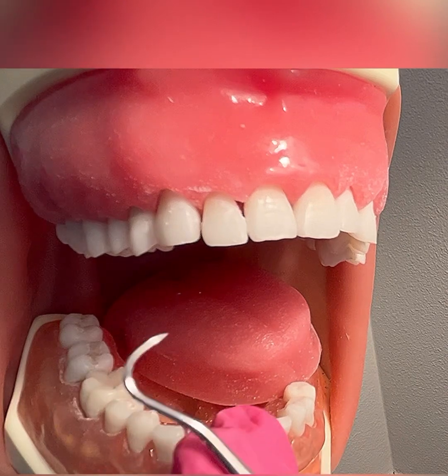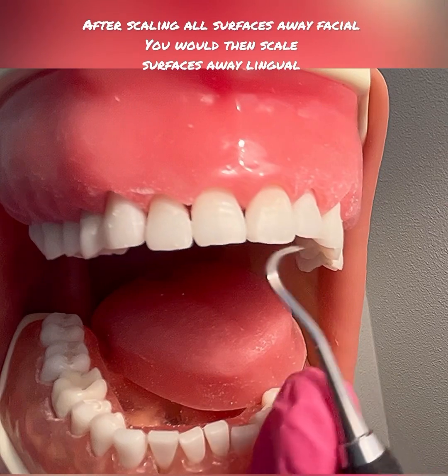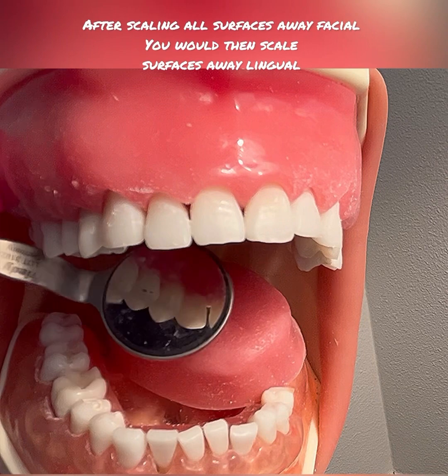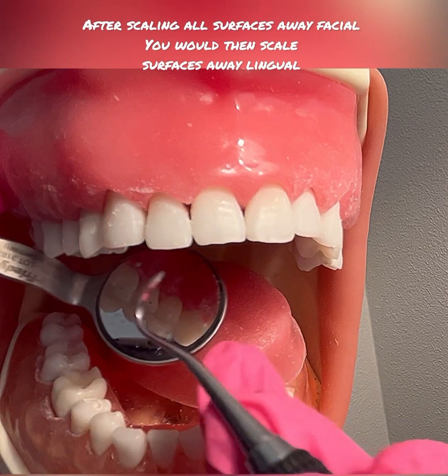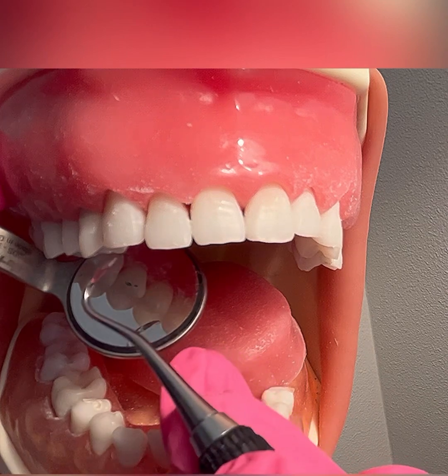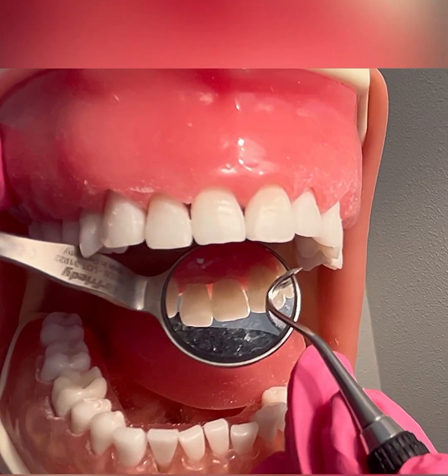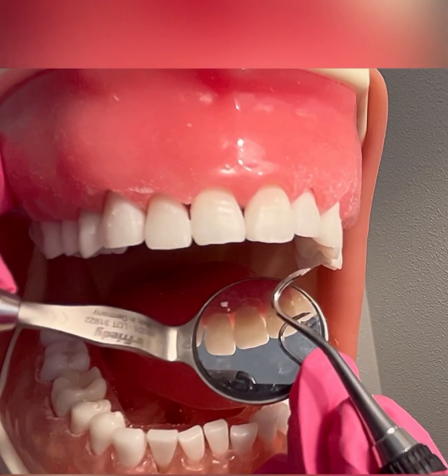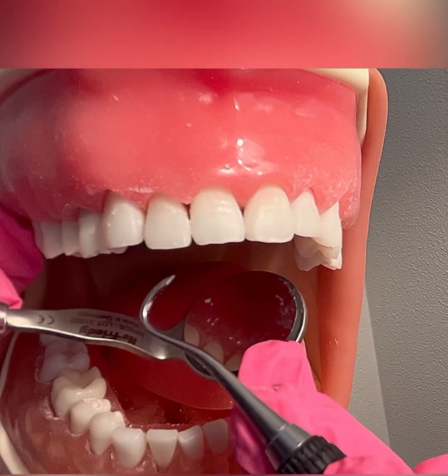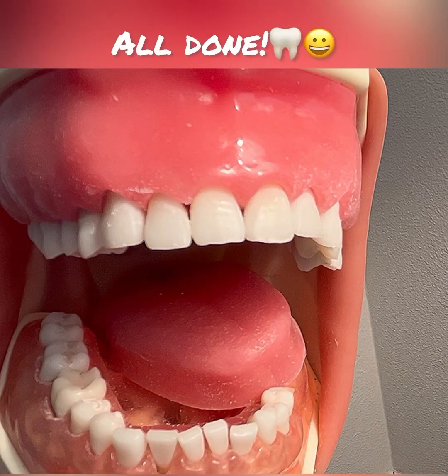I would go ahead and continue scaling all surfaces away to tooth number 11 on the facial. Then I would get my mirror, stay at the 12 o'clock seating position, and continue scaling all surfaces away lingual. For right-handed clinicians, you would scale starting on tooth number 6 to 11, surfaces away lingual. Left-handed clinicians would do the opposite — 11 to 6 — staying at the 12 o'clock position for surfaces away lingual. And after that, you are done.